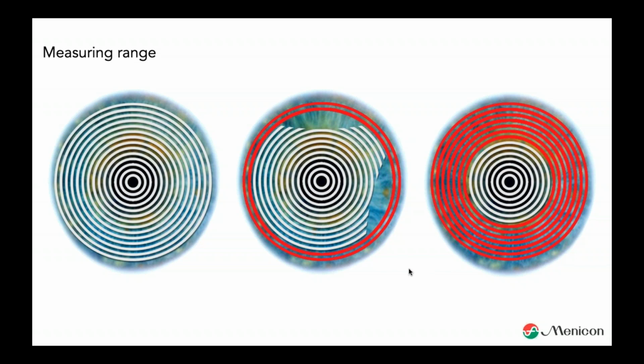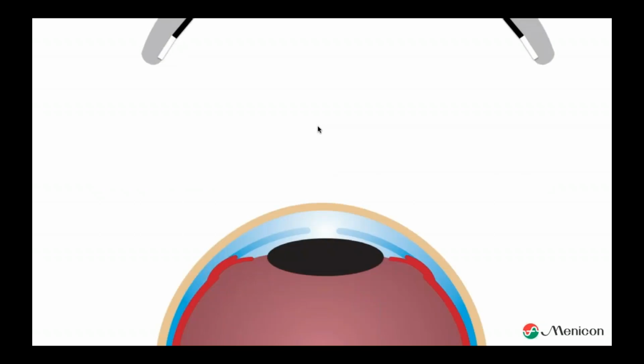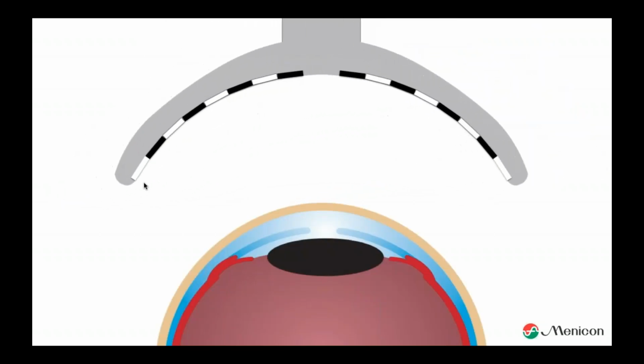There's another thing I learned a couple of years ago, and I want to share with you, because the measuring range also depends on the curvature of the corneal surface. This is a bit of theory, but I think it's interesting to know, because it lets you look differently at your topographer as well. Let's say we have an eye and we have a topographer. What you see happening here is that I tried to create a topographer with my best PowerPoint skills. But just to explain what is actually happening, what is a topographer measuring? Well, I heard stories in the world that a topographer is measuring the height of the cornea. And that's absolutely not true.